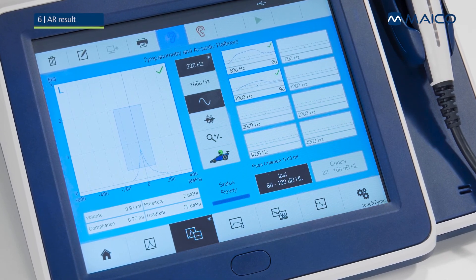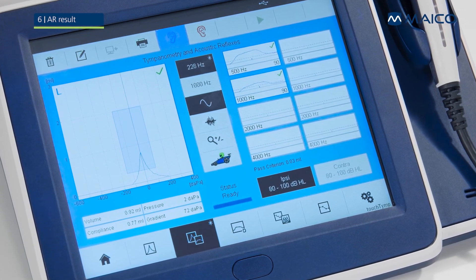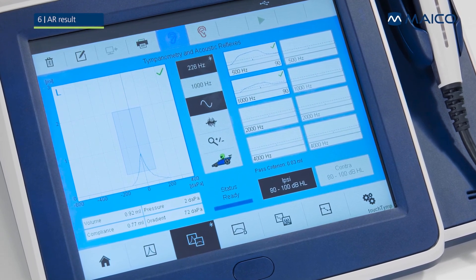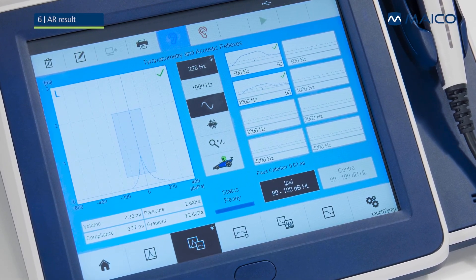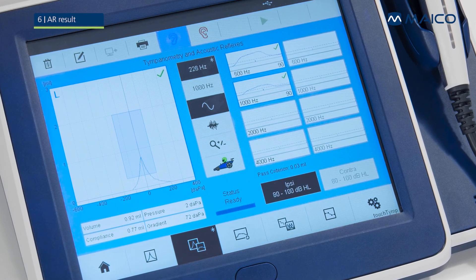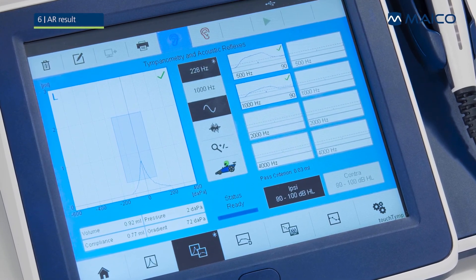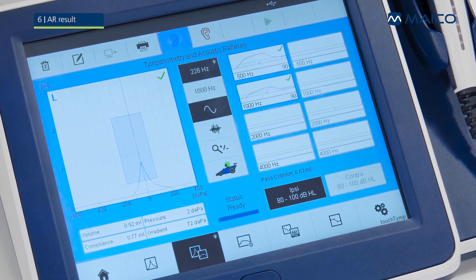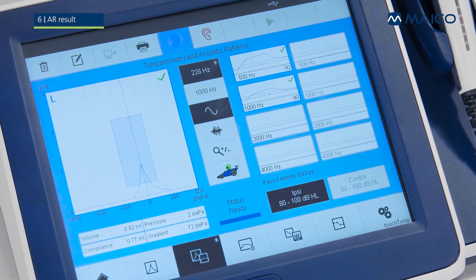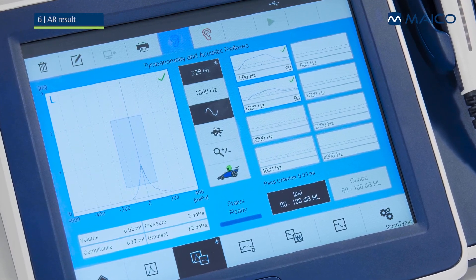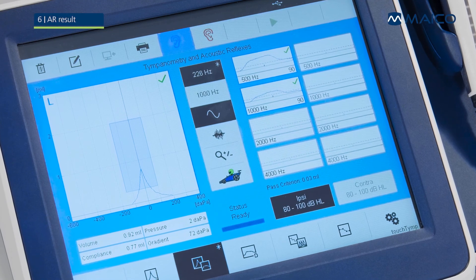A green checkmark indicates a present reflex. A red cross indicates no response. To be considered as a pass, the maximum amplitude of the reflex shape must reach a pass criterion within a defined time range. Otherwise, it is considered as no response.